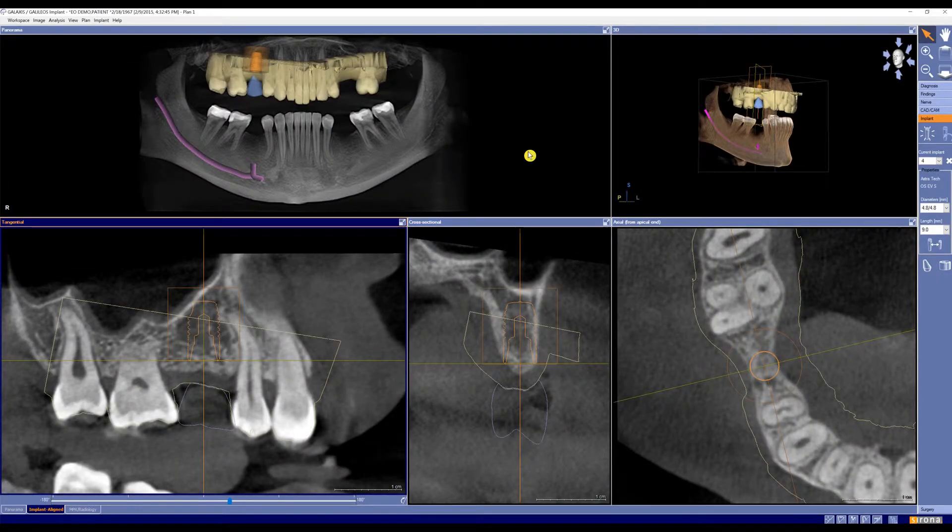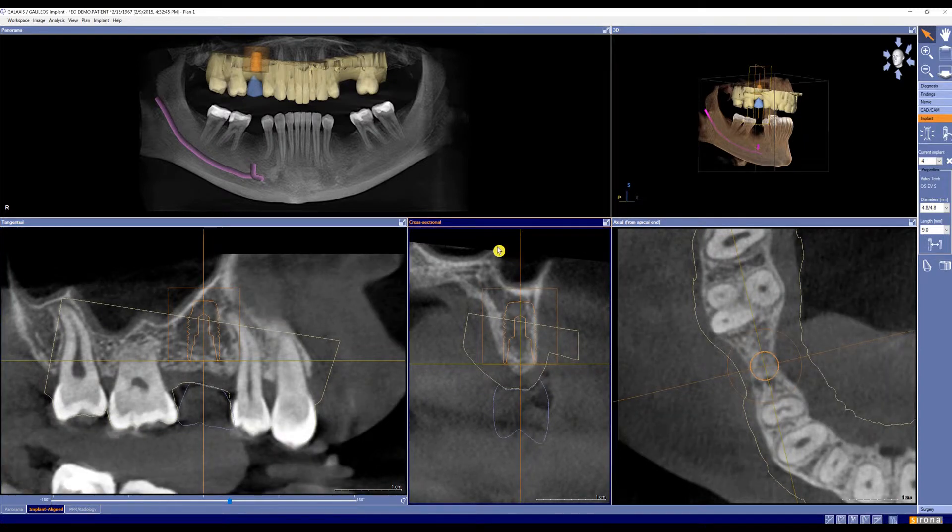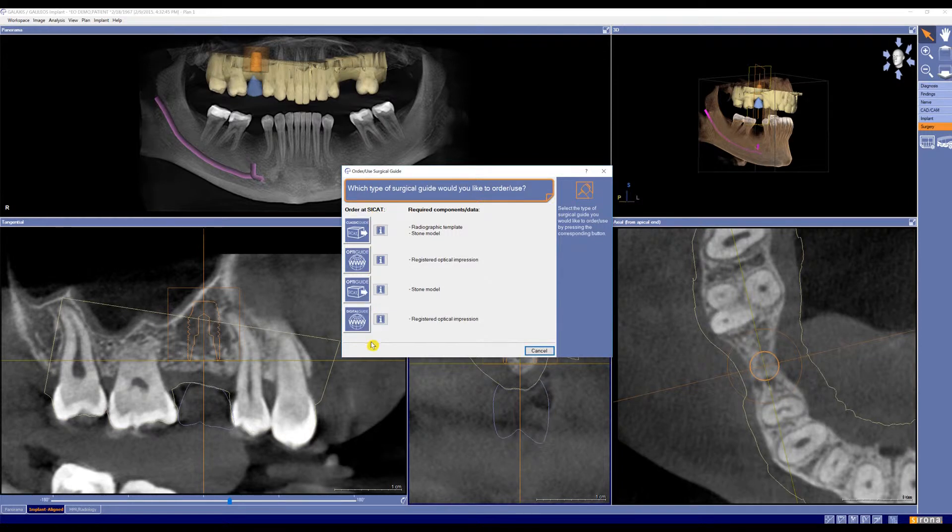Back in our software, you'll see that we have our implant placed with our SSI file pulled in. We have our crown, everything is looking good, and we have picked an implant line that is supported by CEREC Guide 2. So if we go down to surgery and click on surgical guide, you'll notice that we still don't have the option for CEREC Guide 2.